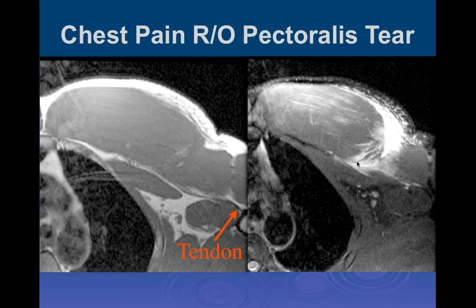If you really don't see any tendon on the muscle side, then there's a pretty low chance that you can do surgery. So there could be a discussion, but typically, and again, this isn't completely an imaging decision. A lot more goes into it clinically than just the imaging technique.